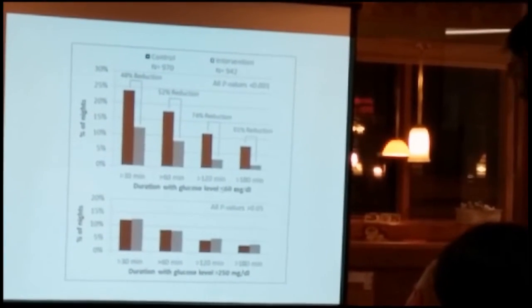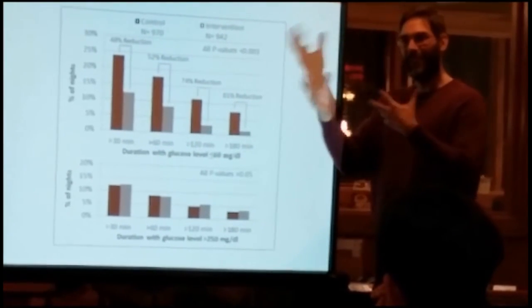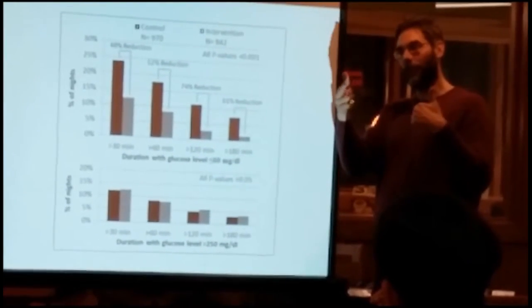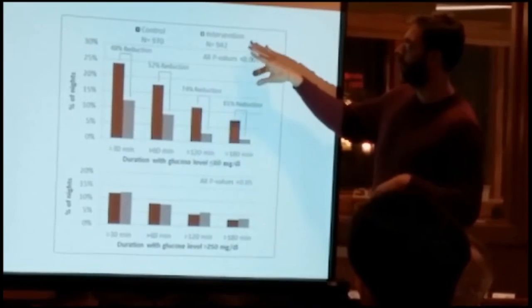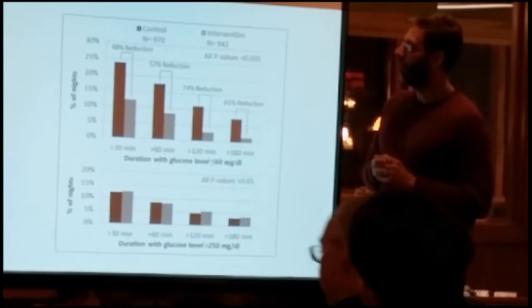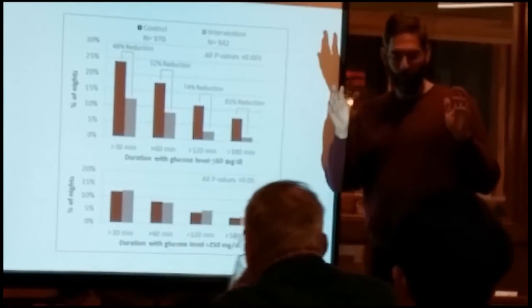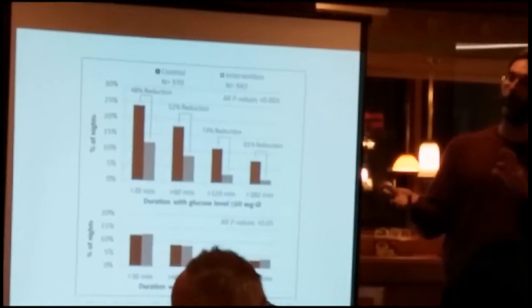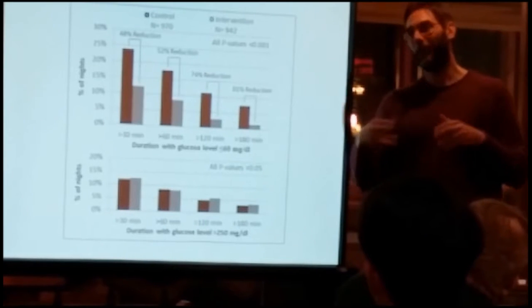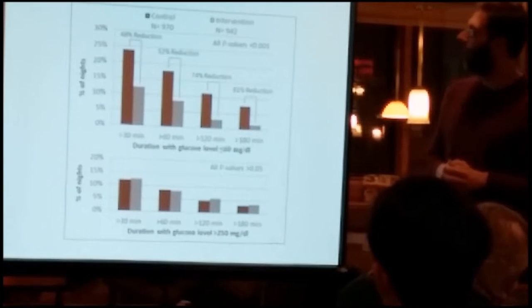So this is data from a study we did with 15 to 45-year-olds, and we didn't see an effect on the 15 to 21-year-olds versus the 21 to 45-year-olds. And the way we did this study was a little bit unusual, novel. People would have to start the system up at night, and they didn't know if it was going to be a night where the system was working or not working. The reason we did that is because we had to show that it worked, or it didn't work.